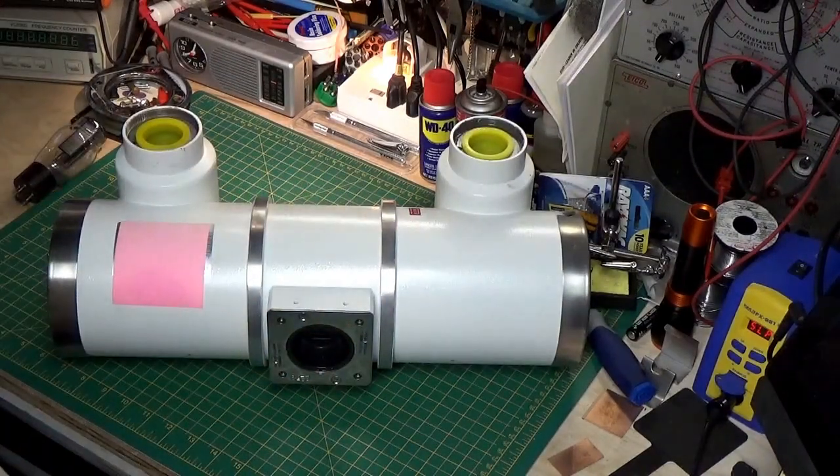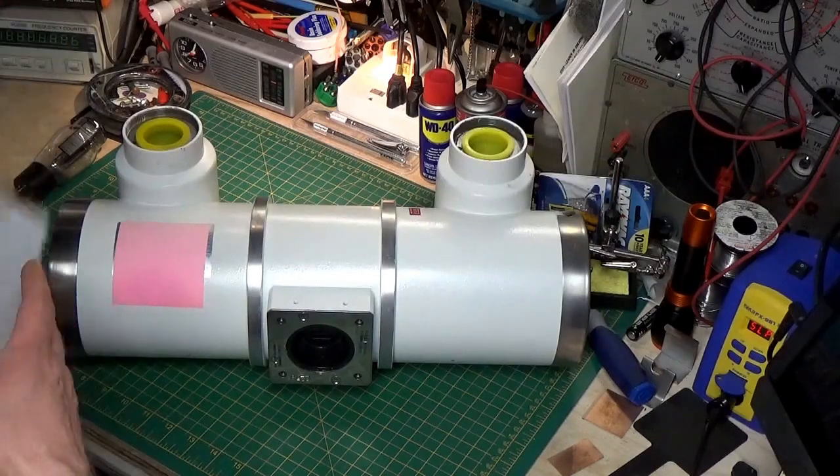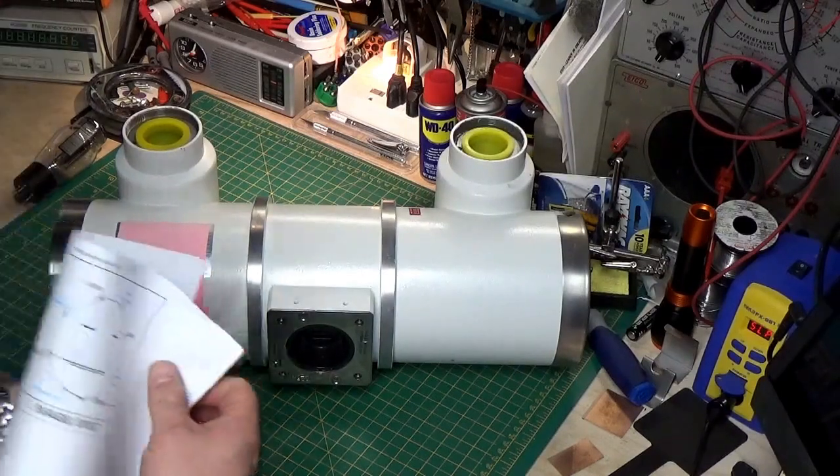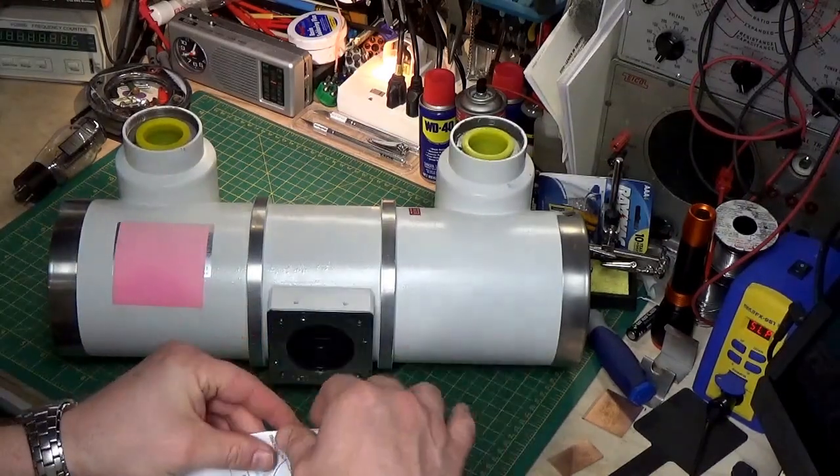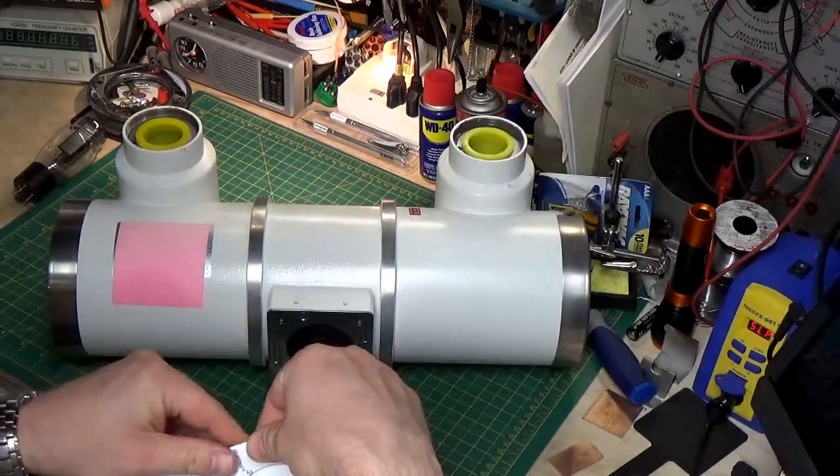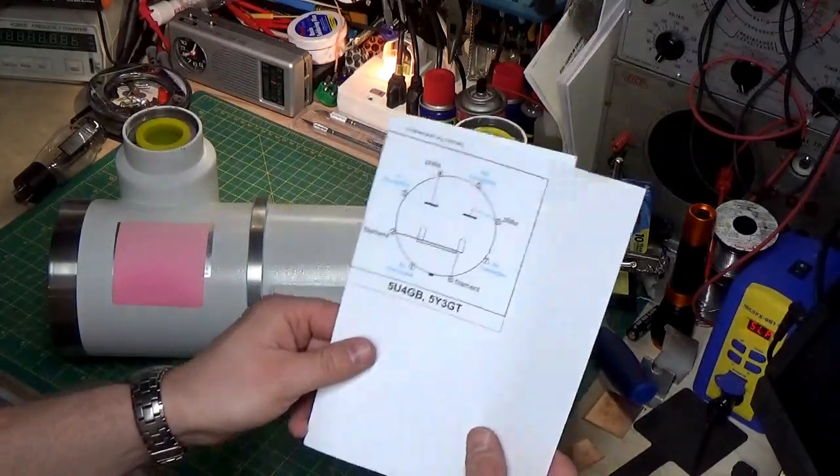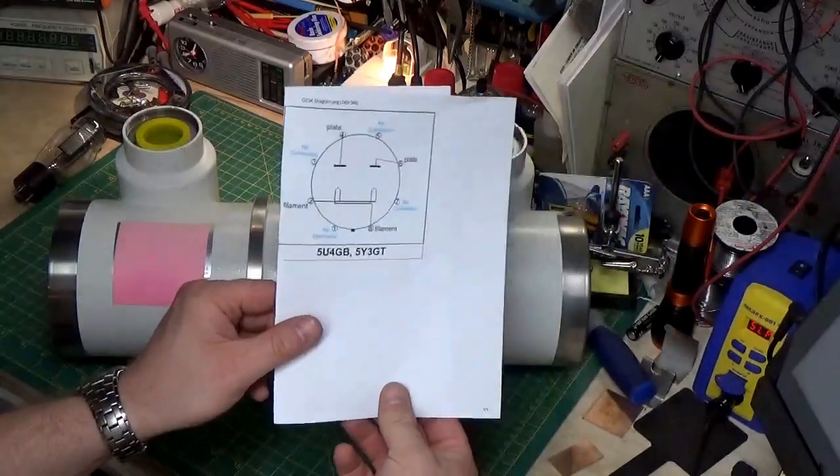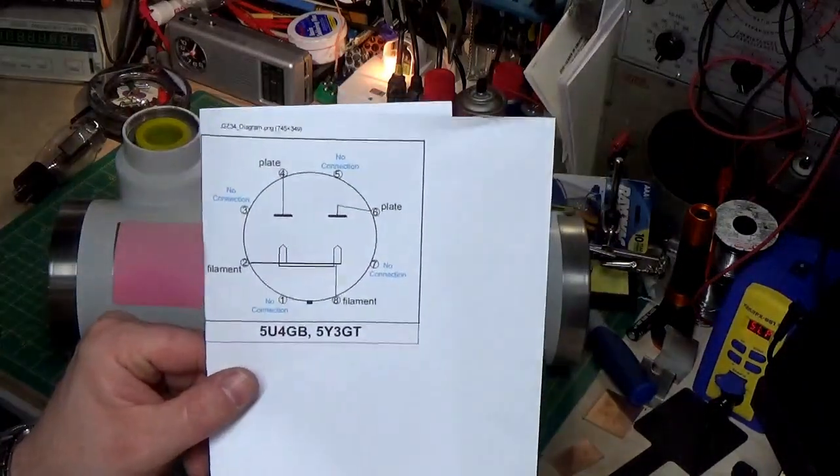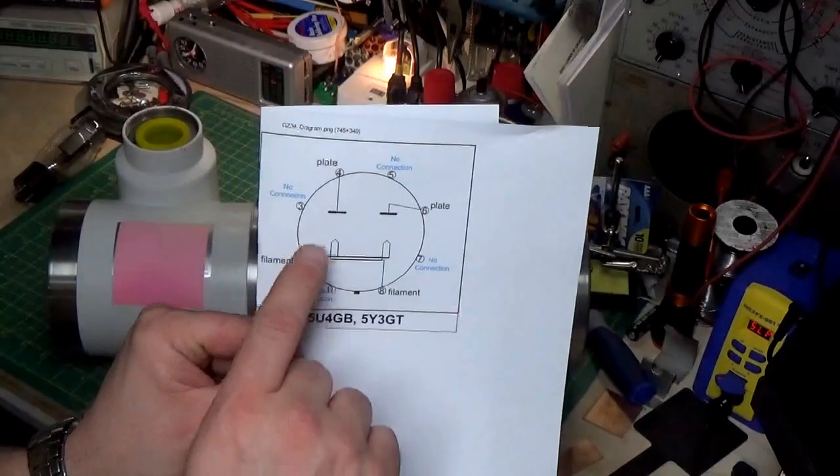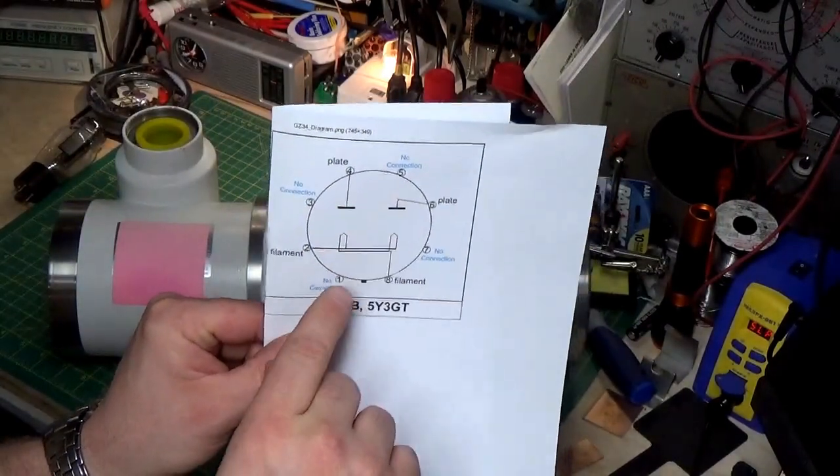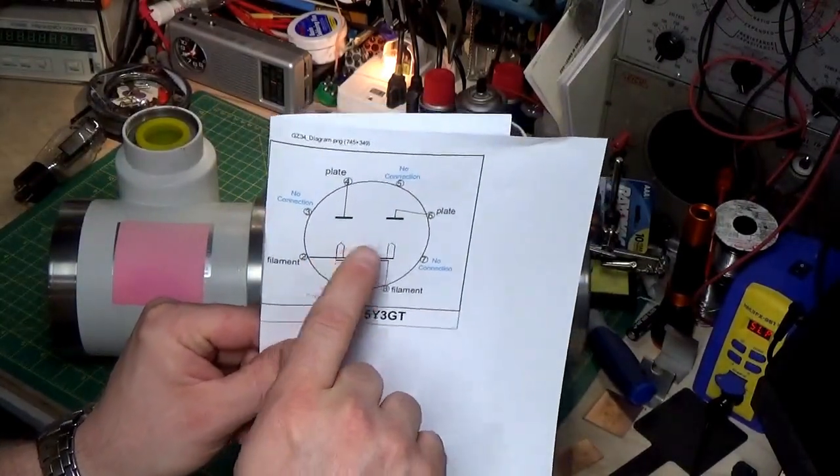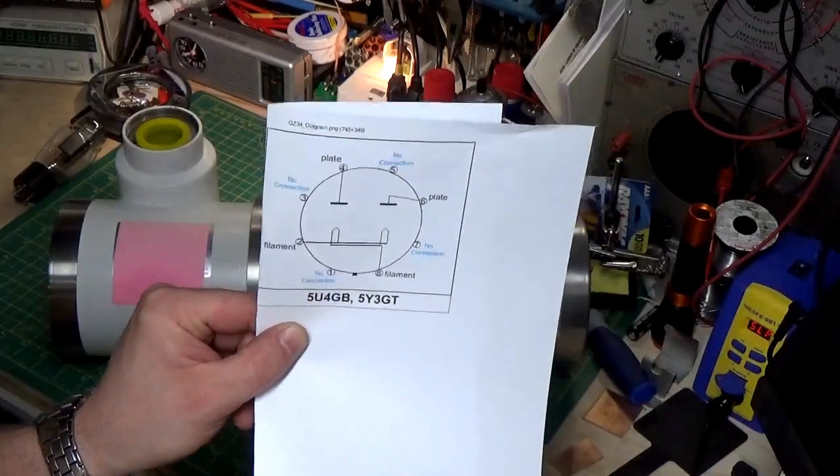Now, if you look at the diagram here, we have a little schematic. You'll see like a schematic drawing of this. And basically what you see is your two anodes, or your plates, and your two cathodes, or your filaments.